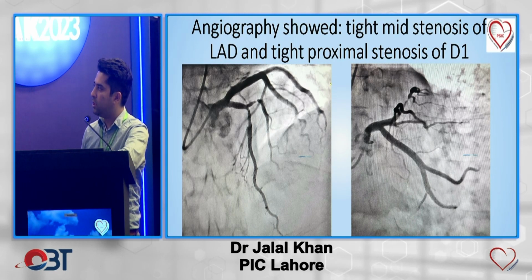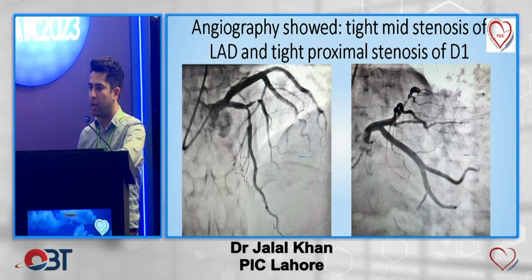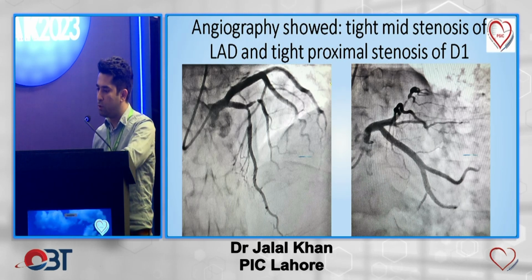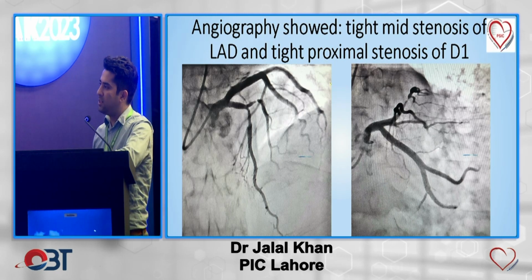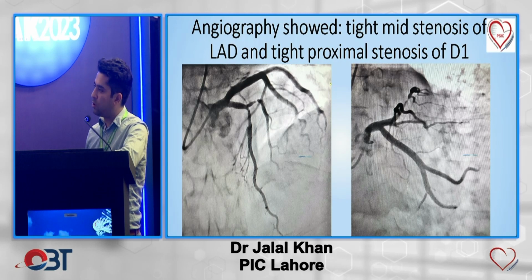We can see there are 2 lesions, a severe mid LAD lesion and proximal diagonal 1 of good diameter, which shows severe stenosis. The angiography was done with a low amount of non-ionic contrast, around 12 ml.